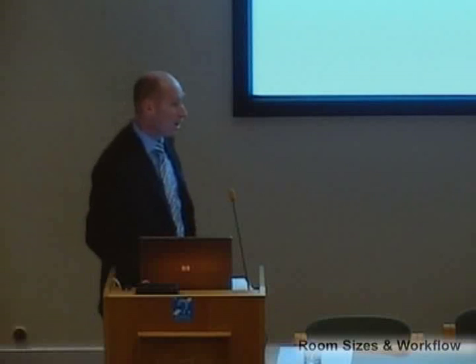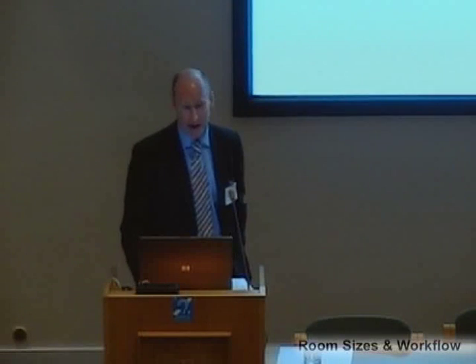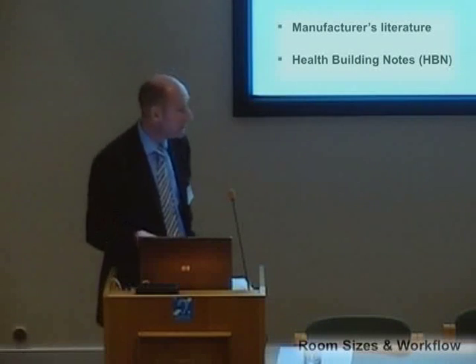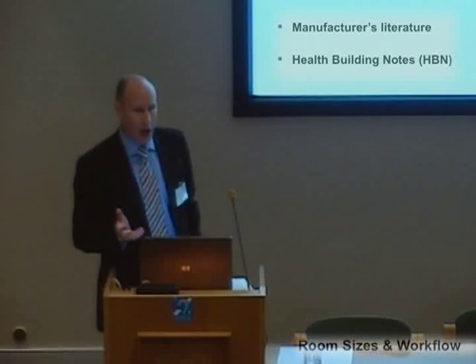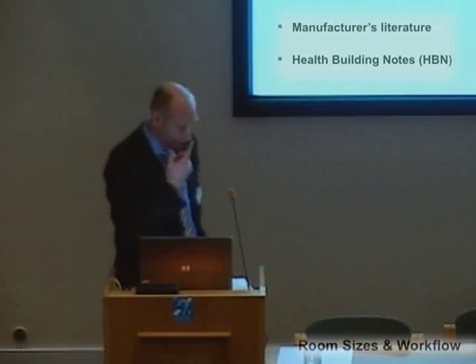So I'm often asked, how do we get a specification for a room size? And the literature is pretty thin on the ground, I must admit. We've got two main sources, obviously manufacturer's literature, which is ours, which is fine, and health building notes. The manufacturer's literature, we're going to be biased. Every manufacturer will be biased. We want to win the business.